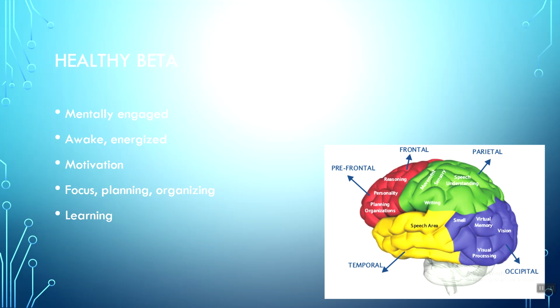And so beta, unlike delta, remember how I was saying delta makes this long trek across lobes? Well, beta is a focal pattern, a frequency that likes to live in tiny little neuronal pools. So beta likes to hang out in its own little hood, right? Beta facilitates local communications. These slower frequencies of delta and theta serve as carrier waves on which faster frequencies ride, which is why when you look at the EEG and you're like, I can't read that, it's because you're seeing 4 frequencies at once. You're seeing delta, on top of that maybe some theta bumps, and then some little beta spikes, right? But beta's local.